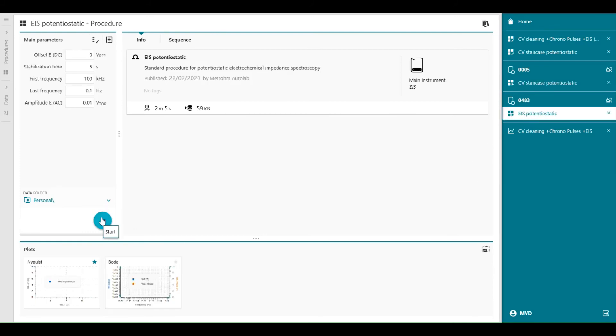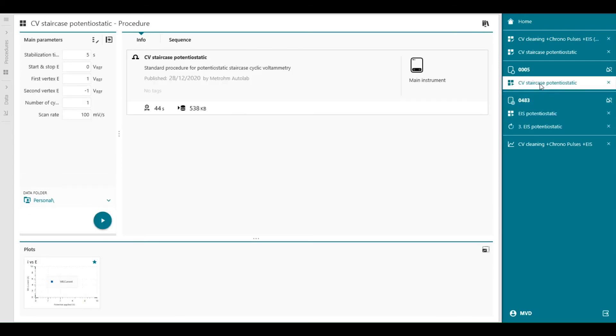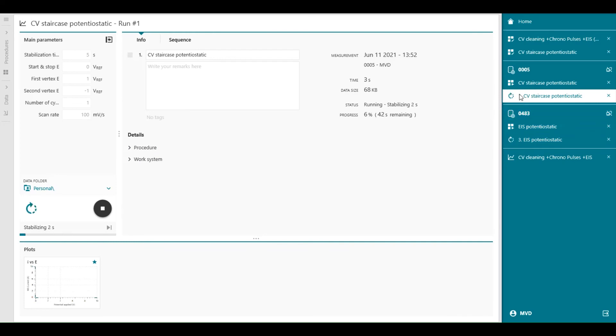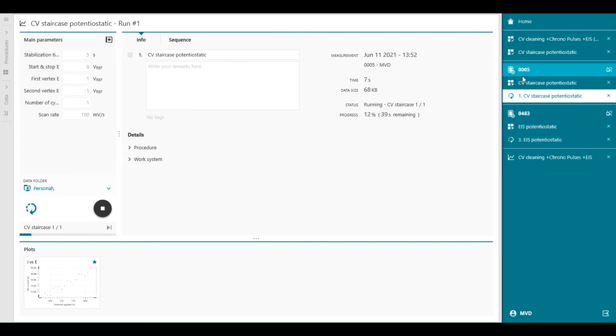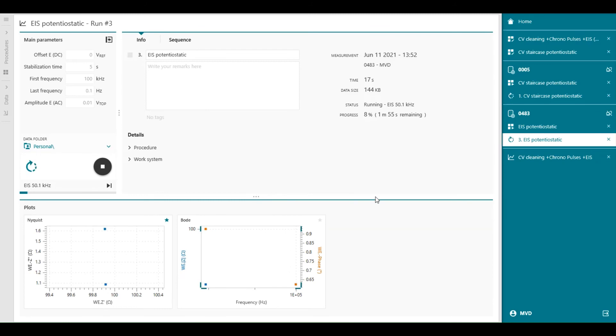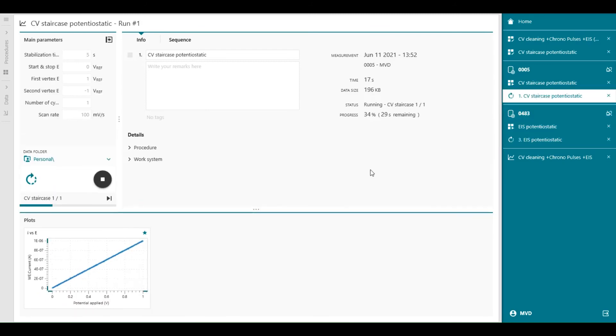We can start first with the impedance measurement. Press start. And at the same time, we can also start with the CV on the other instrument. You see, both procedures are running on two different instruments in the same network. And you can visualize the impedance plot, but also the CV data at the same time.